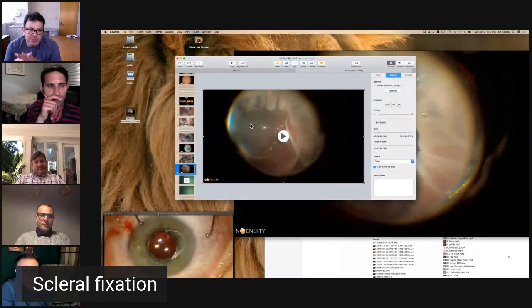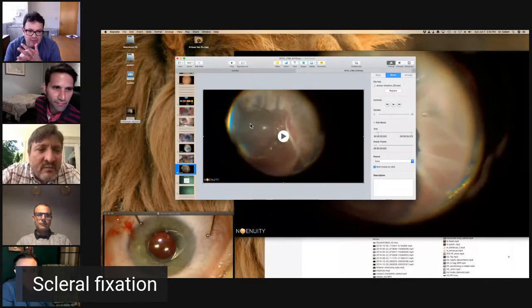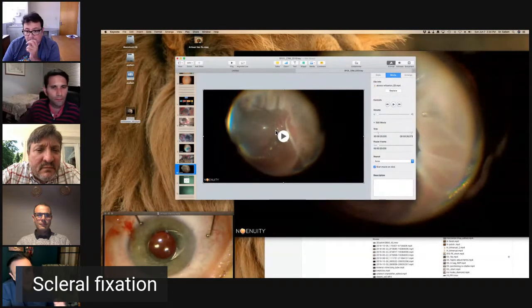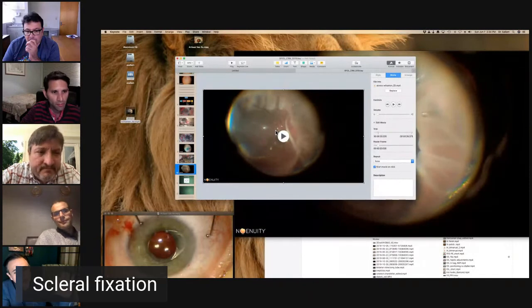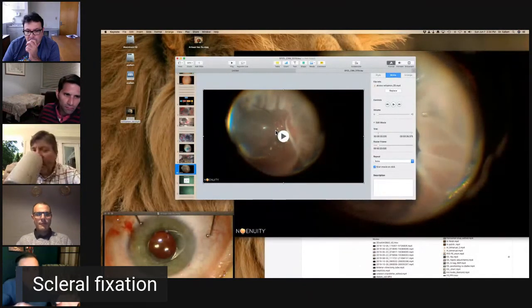But I think the important point that you're trying to get across, and me too as well, is make sure you don't get a spaghetti whatever way you do it. Just make sure you don't get suture tangling. And one other very important point is that when you're manipulating these sutures or you're feeding them, use serrated forceps. Because I use the ILM forceps, and basically you're trying to feed yourself, grip a little.